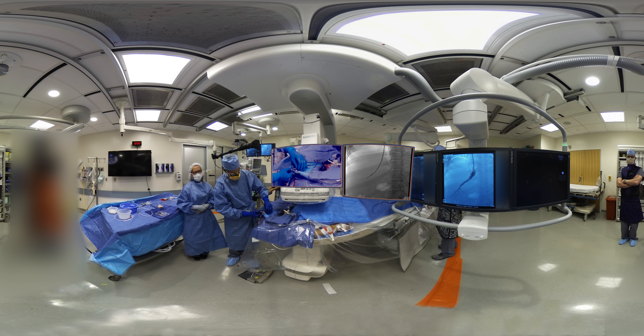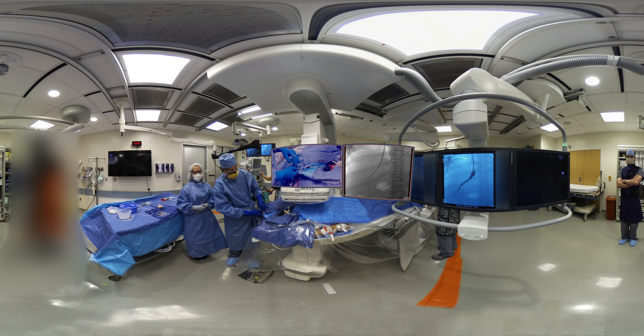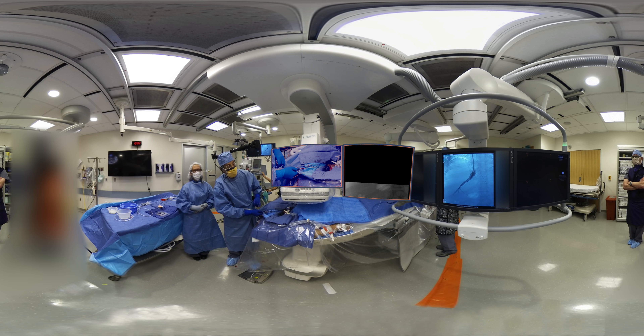The next thing I'm going to do is intensely turn the needle system anteriorly so it takes a bite out of the bottom wall of the vein and is secure. That way, with the patient breathing, I'm not going to be surprised and find it migrate back — which is often a point of difficulty, having things slowly move backwards unintentionally in the vein with respiration. The next thing is to move the outer sheath back. Checking on fluoroscopy, we want to leave the needle room to exert its curve unimpeded by the outer sheath.